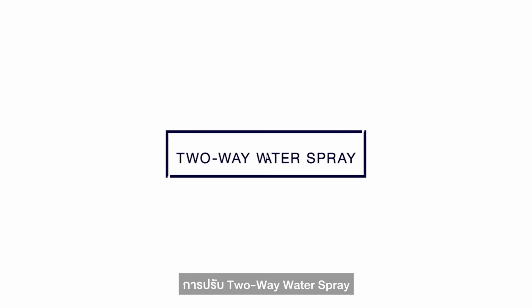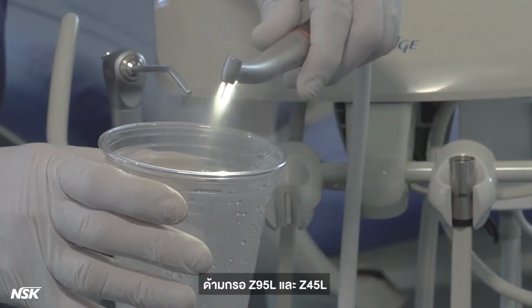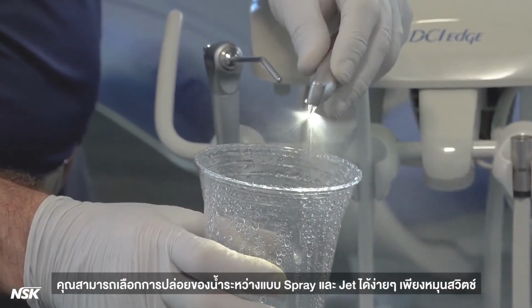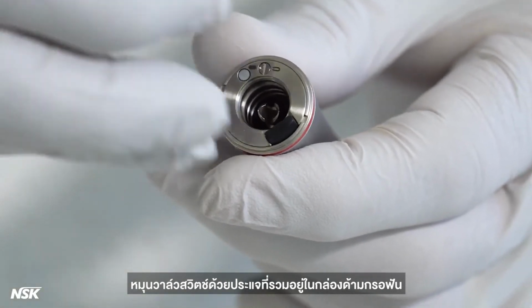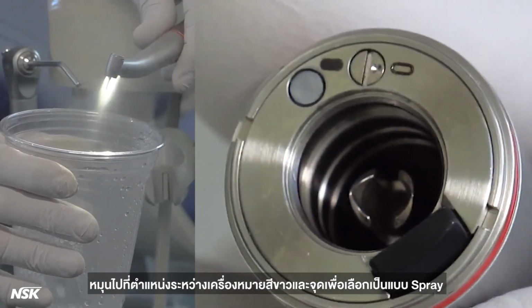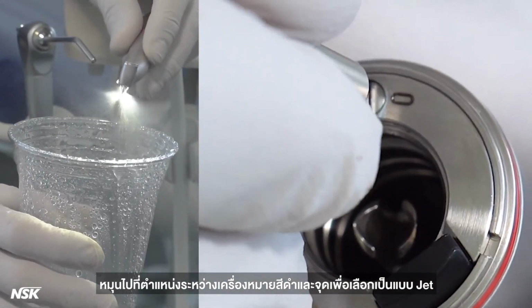2-way water spray adjustment. With Z95L SW and Z45L attachments, it's easy to switch between water spray and water jet at the flip of a switch. Turn the switching valve with the wrench included in the handpiece box. Align the white mark and the dot to set the water spray shape. Align the black mark and the dot to set the water jet shape.